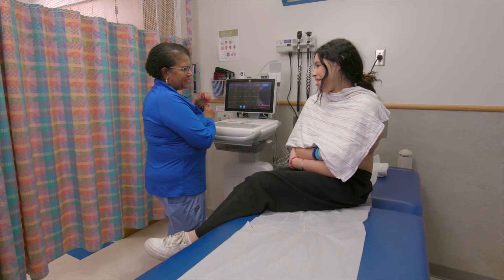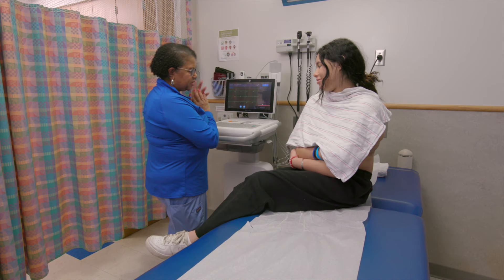Good afternoon, how are you? I'm good, how are you? Could you verify your name for me? I see Stein. Good to meet you.